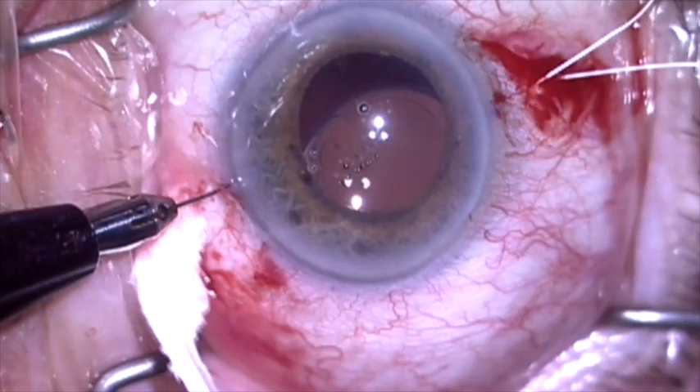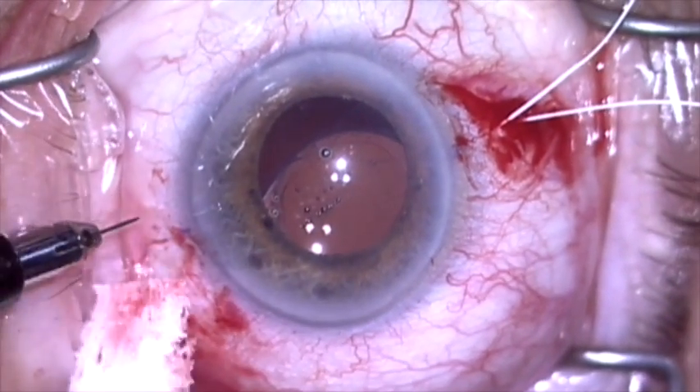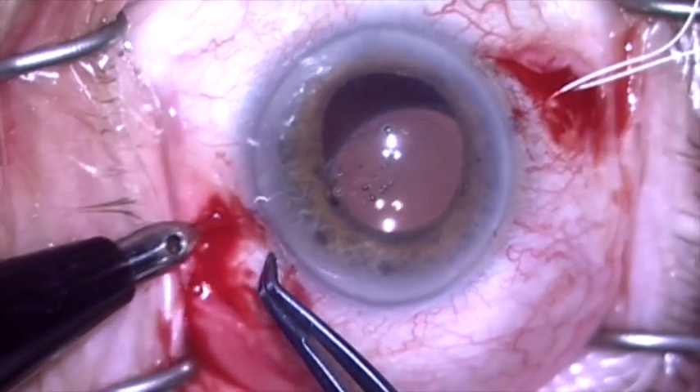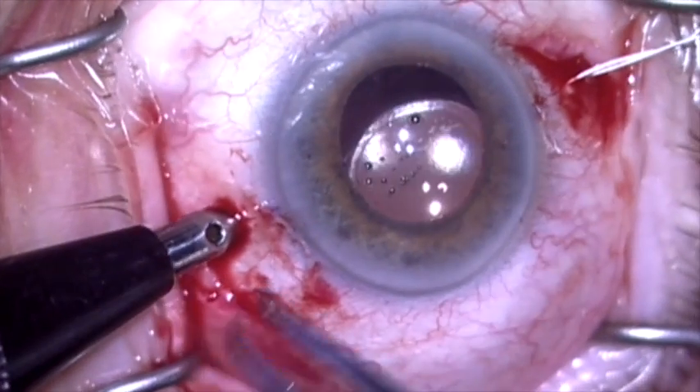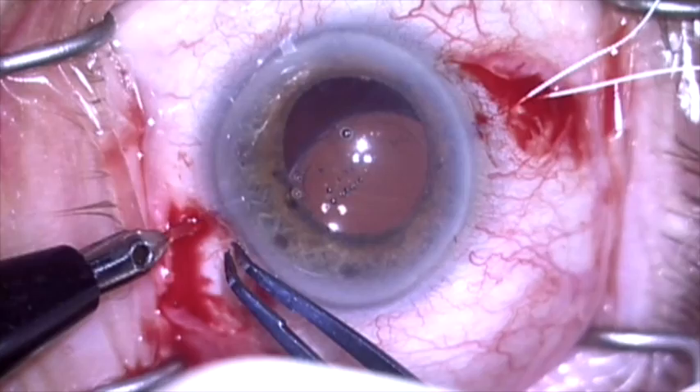I'll now repeat this exactly 180 degrees away. I'm going to make a radial groove going from about one and a half millimeters posterior to the limbus to about three and a half millimeters posterior to the limbus, and I'm going to puncture and create sclerotomies at the top and bottom of the groove.